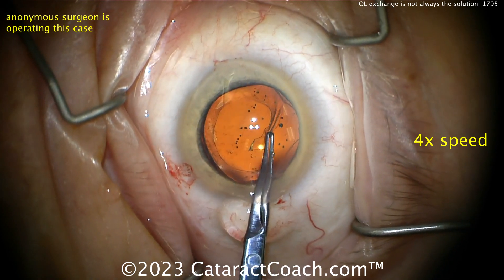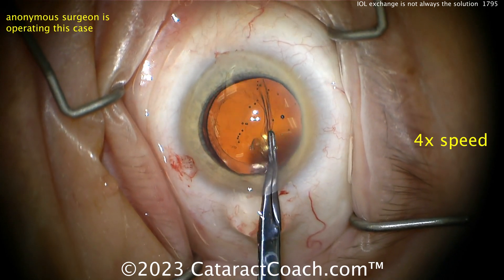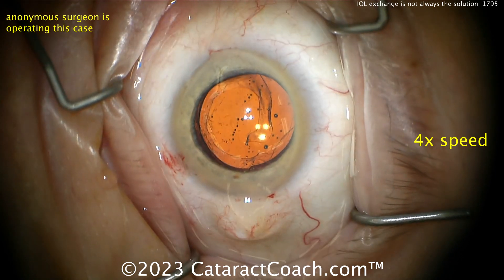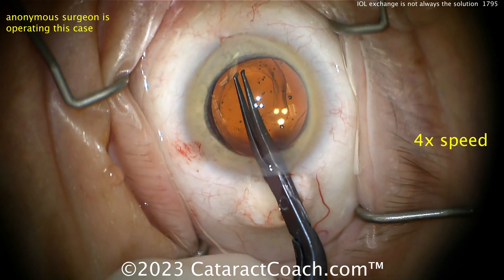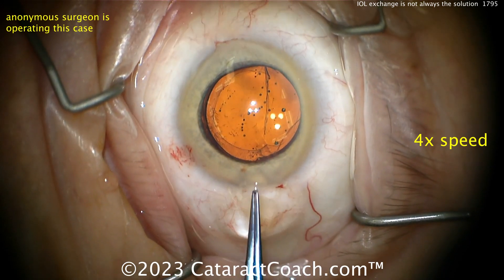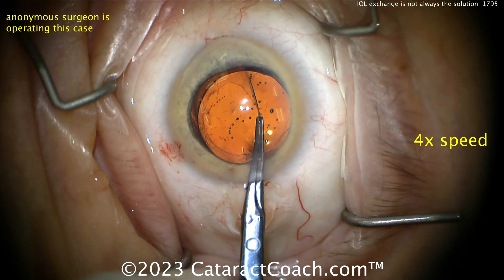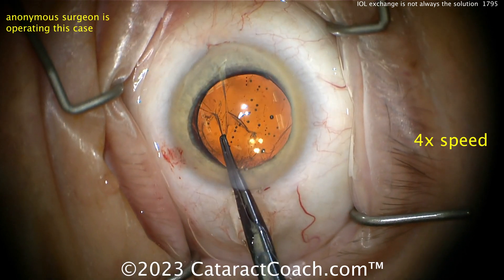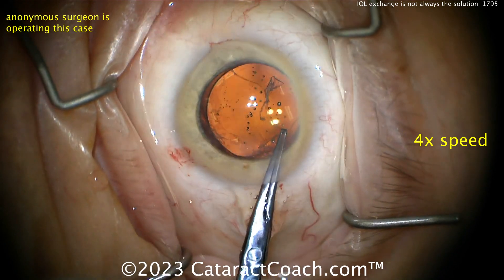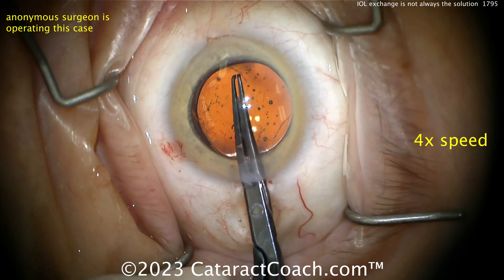Bring it around here — oh, going out, going out! Whoa, whoa, whoa, that's going way out there. That's making my heart rate go up a little bit, I'm getting nervous. Now cutting the other way — yeah, that was a little too far out for my flavor, way out to the zonules almost. I'm not sure what's going on there. Oh, be careful — oh my goodness, more capsule! Stop, stop, stop, stop. That's a little aggressive for me; maybe your tolerance is higher than mine. Forgive my theatrics.